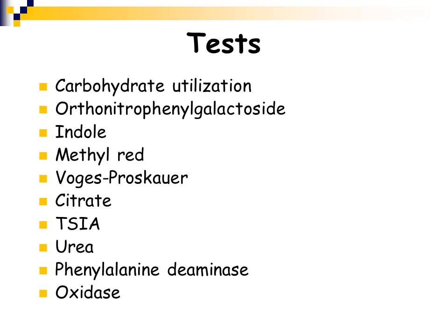analyze all of the results that come out of a machine and be able to say, oh yes, this makes complete sense. All the test reactions are correct, and the machine saying it's E. coli, yes, that makes sense, it is E. coli. You need to be able to identify discrepancies and be able to see a test reaction and say, wait a minute, that test reaction isn't matching with that organism. I need to repeat this test. So it's very important to understand what the tests are, how to perform the tests, and what the reactions mean.